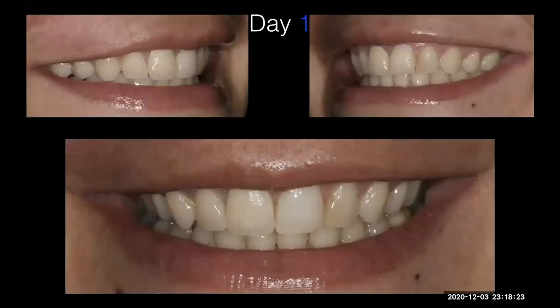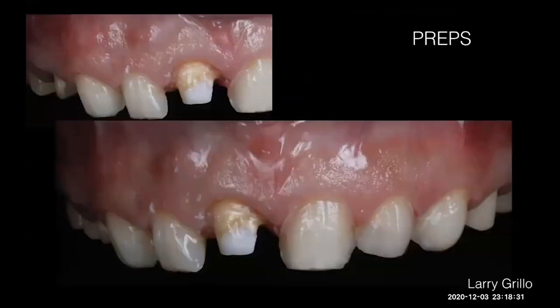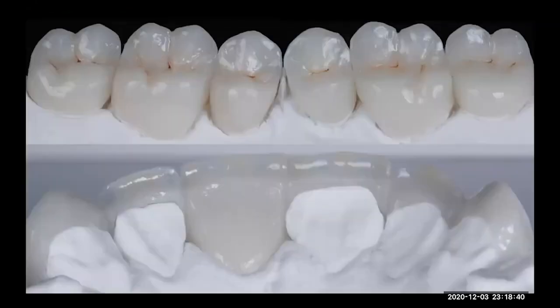This is another case where we are doing different crowns, different veneers with different stump shade colors. So this is our patient with the preparation. In that case, for example, normally we wax everything. We use the geo wax a lot. We wax 100% everything in wax and then press.